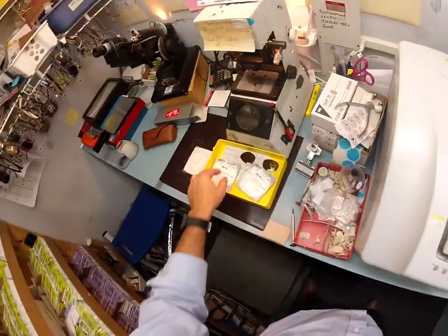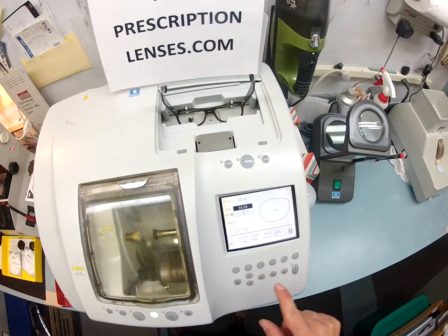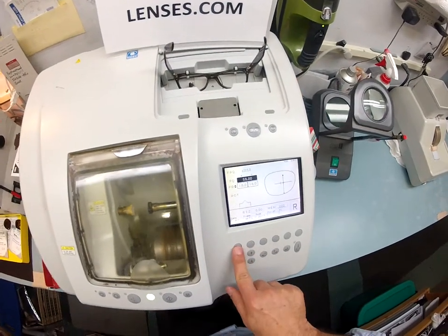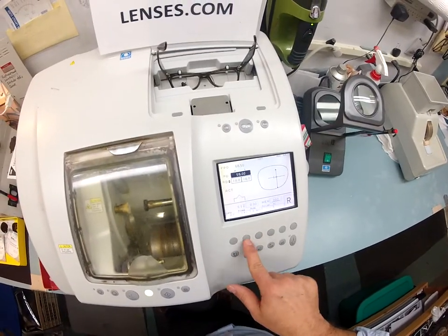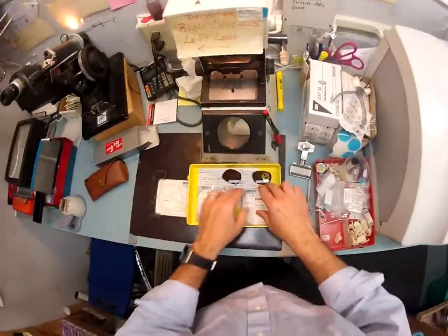I'm gonna pull up the shape of your lenses onto the computer. Your pupillary distance is 59 — let me type that in. This is a polycarbonate lens being cut for a plastic frame; let me run back through that cycle — plastic.